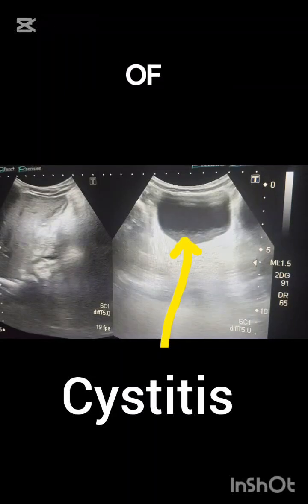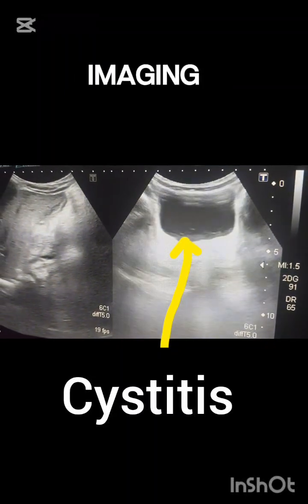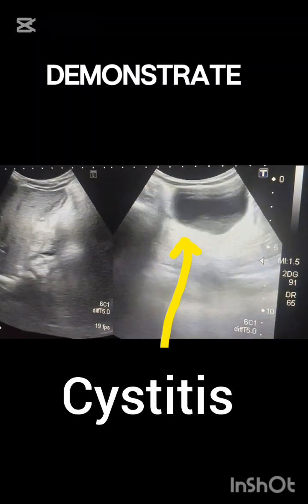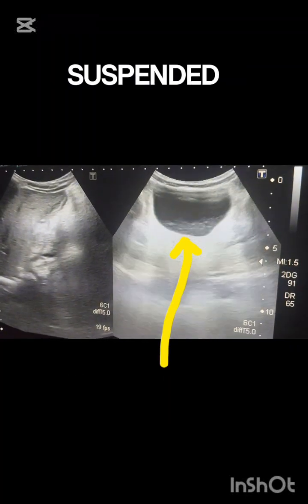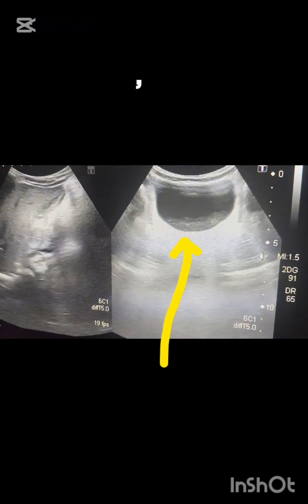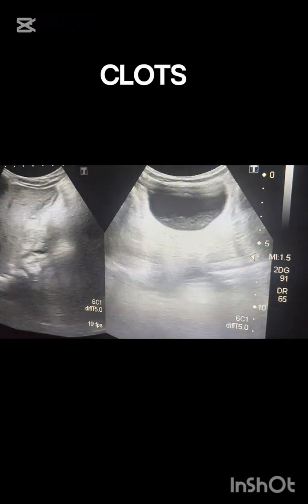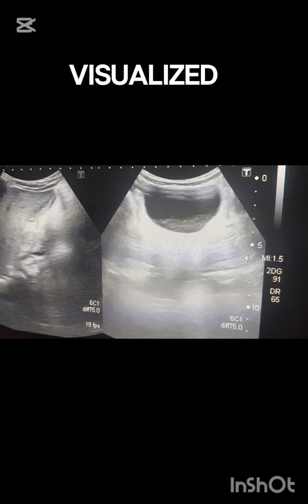Increased vascularity of the bladder wall may also be detected with color Doppler imaging. The bladder lumen may demonstrate echogenic debris or suspended particles, reflecting pus cells, sloughed mucosa, or inflammatory exudates. In severe cases, clots or layering material can be visualized.